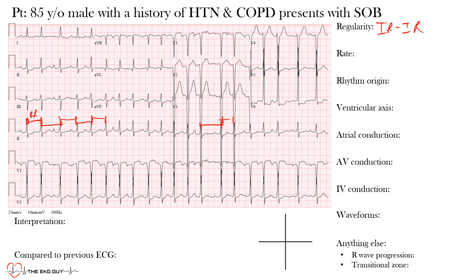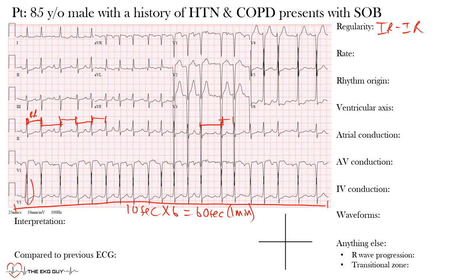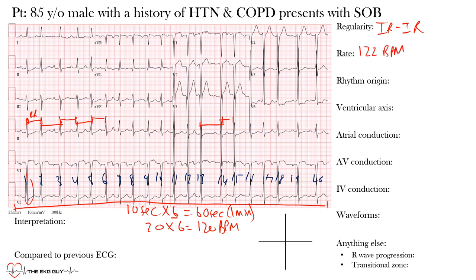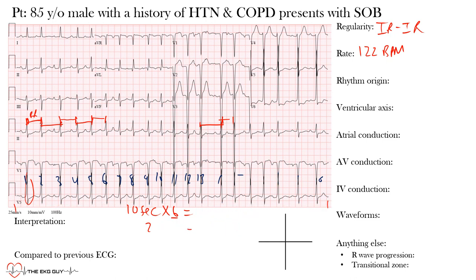Because we have an irregular rhythm, we estimate the rate by counting the ventricular complexes across the EKG and multiplying by six, since the standard 12-lead ECG represents 10 seconds, and 10 times 6 equals 60 seconds. Counting across, we get 20 complexes; 20 times 6 gives a rate of about 120 beats per minute. The machine gave us 122 bpm, which is close enough.